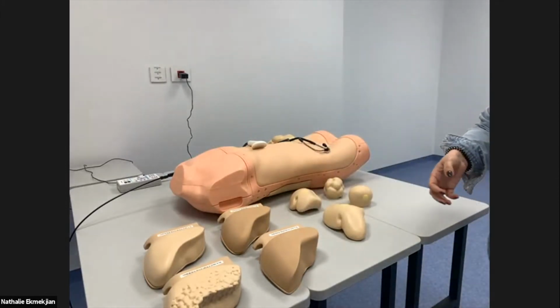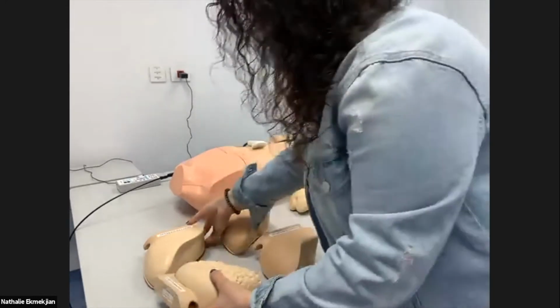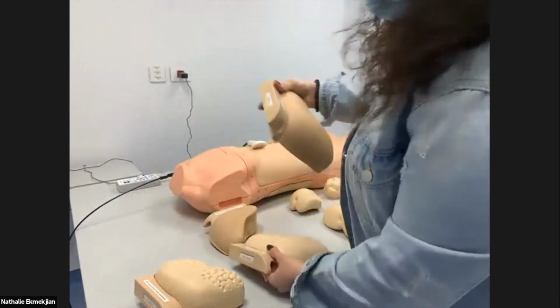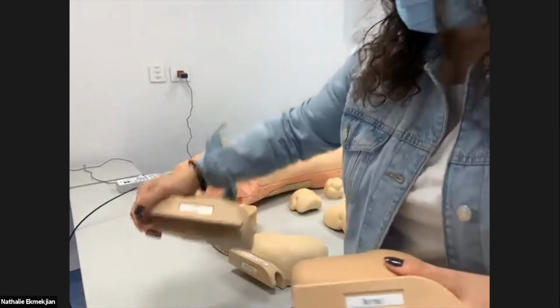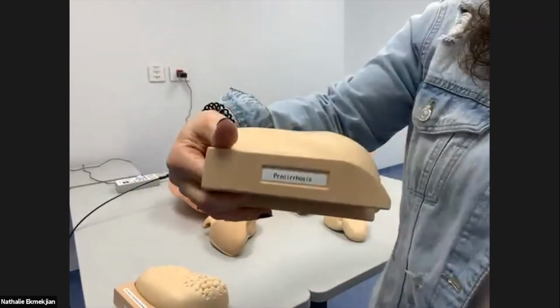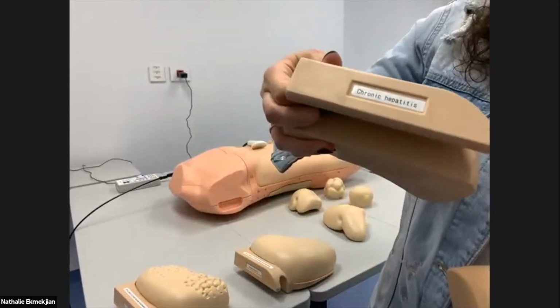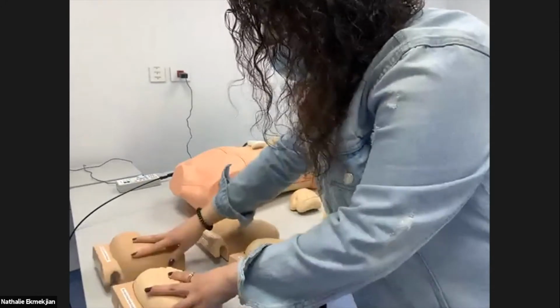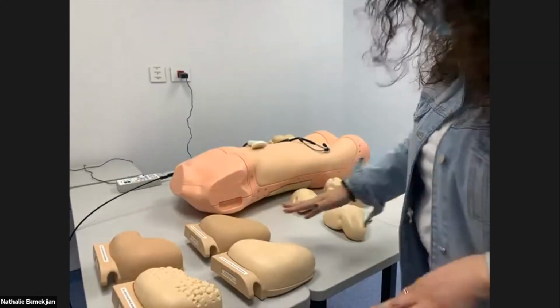And we have 4 interchangeable organs for the liver. So as you can see here, this is the normal. This is the cirrhosis, pre-cirrhosis, and chronic hepatitis. So we have 4 interchangeable organs for the liver: normal, cirrhosis, pre-cirrhosis, and chronic hepatitis.